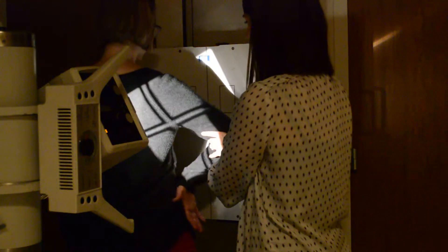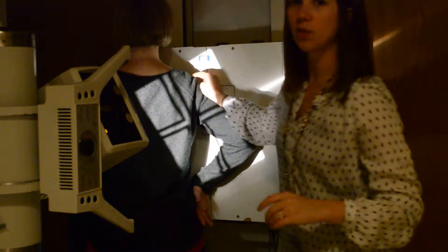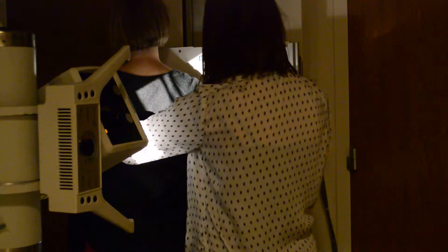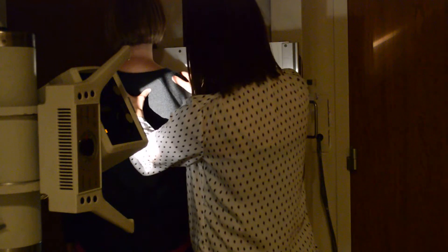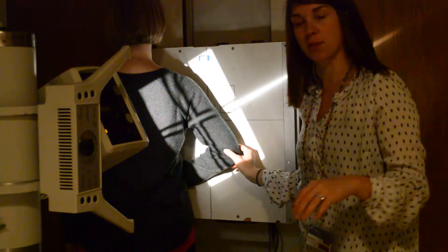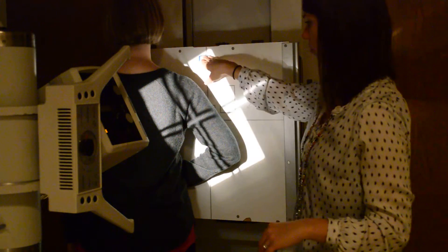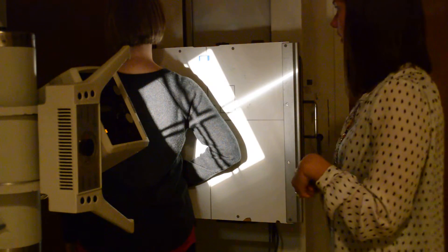Have her put her hand on her hip and oblique the body. The humeral head will actually touch the IR when you do this PA. I want less OID. I'll have her take a little bit of a step to her left to get her in the crosshairs. Palpate and make sure you've got light above the shoulder. Make sure that the epicondyles are perpendicular to the IR and that you have light below your marker. Measure through your central ray, give gonadal protection, ask your patient to hold still, and click.